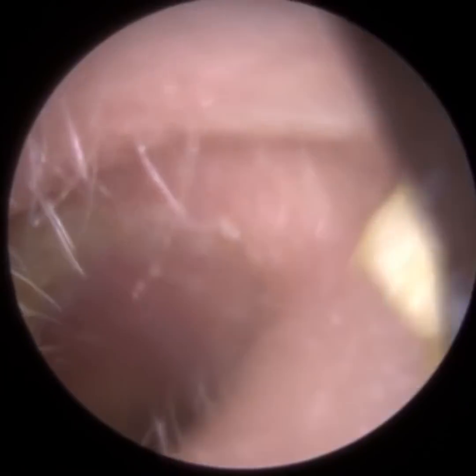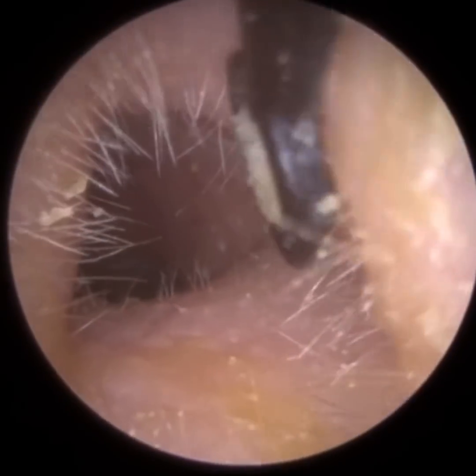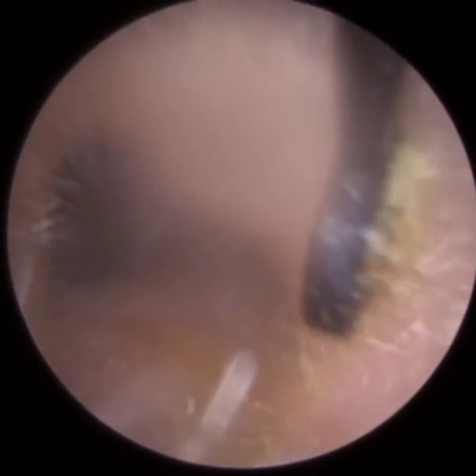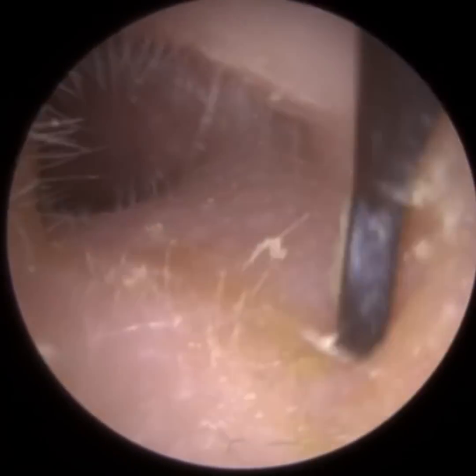And if someone has got what we call glue ear, so fluid build-up behind the eardrum, so otitis media, the eardrum would vibrate very minimally. And this patient's eardrum was vibrating very well within normal range. So that bulge, I think, they had been a little bit sniffly, and the patient did advise they've been blowing their nose a lot.